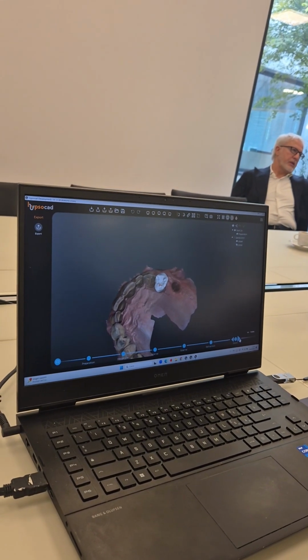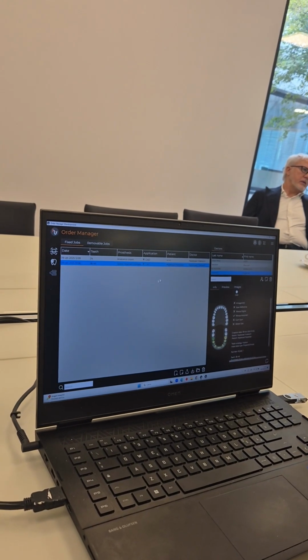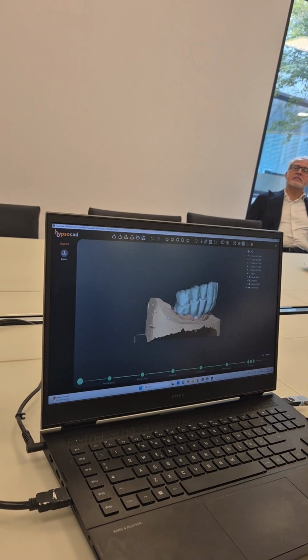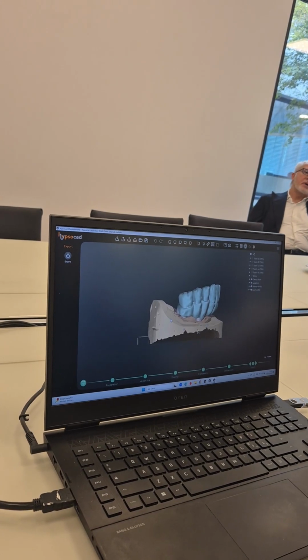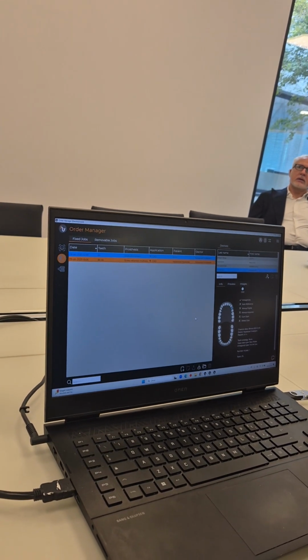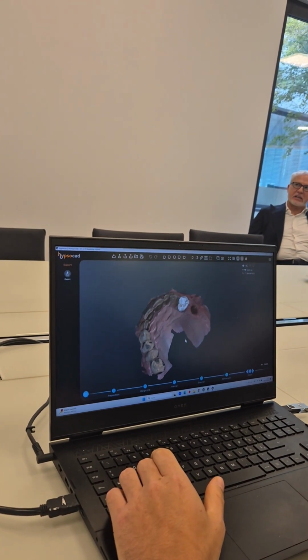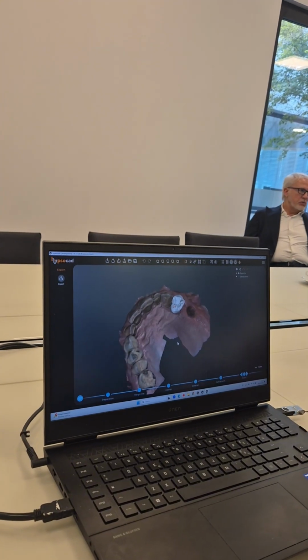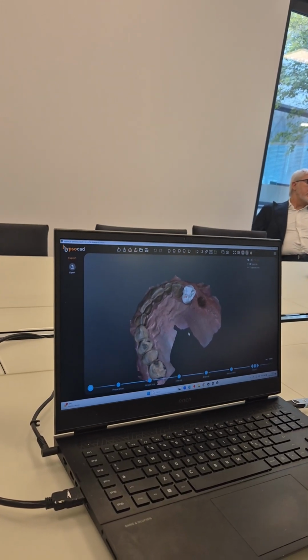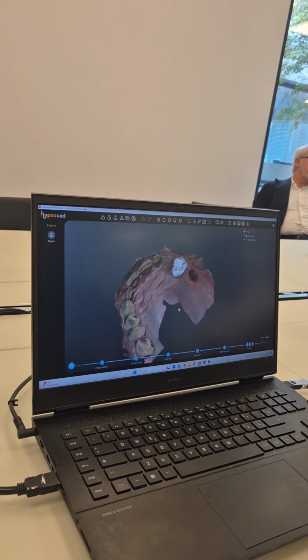Okay, but is it in the plan for the clinic market to make something that automatically, without going to the next step, does something? Absolutely. Can you show me? If you go back to the positioning, the first one, you can just say go. The chair side, it will be exactly the same. So it is in the development step. Because I know you already have all, but maybe for the wow effect point of view, have the possibility to do in one click the finish.